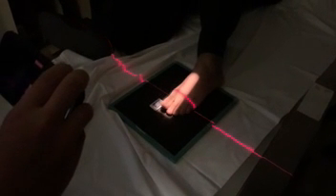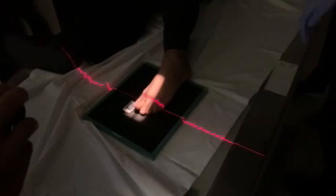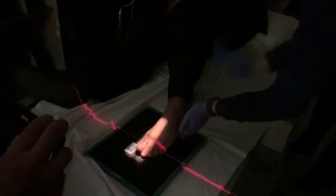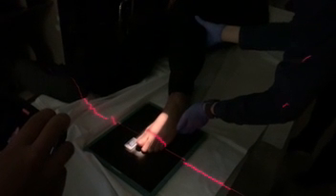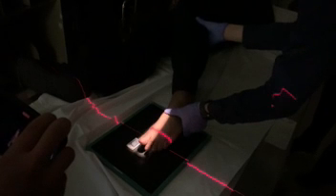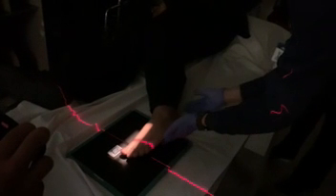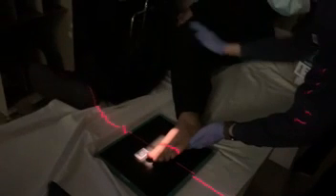So be very careful because this will happen a lot with patients. They will turn their leg but not turn their foot. So it's very important that when you do the oblique, this side of the foot, the pinky side, is following along with the rest of the leg. Okay, so turn your foot as well, Daniel. Good. There you go, right? See, now the foot is obliquing, right? So we need to get this oblique of the foot, not just of the leg.